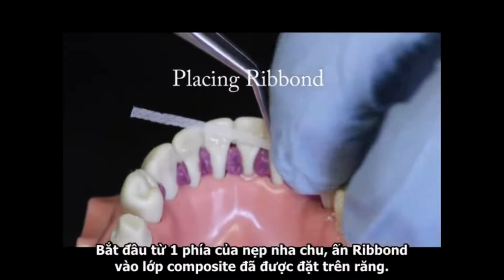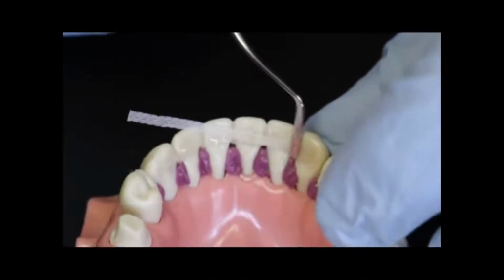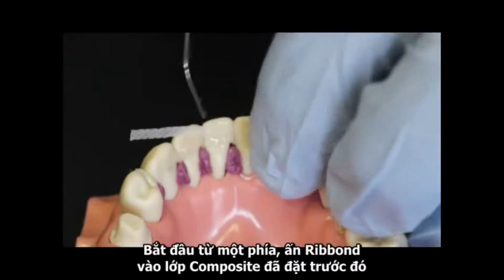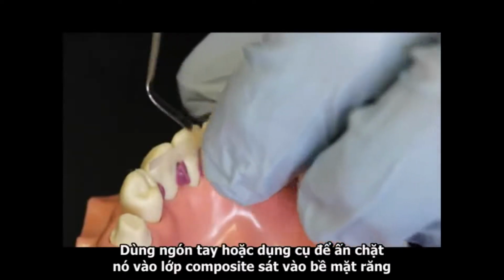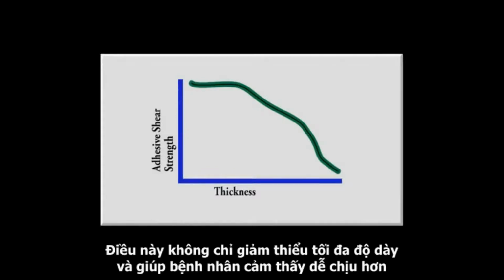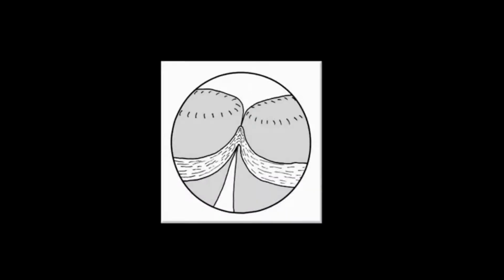Starting at one end of the periodontal splint, press the ribbon into the composite resin that was previously applied to the teeth. You can use your fingers or an instrument to press it through the composite closely against the tooth surface. Remember, the thinner the bond line is, the better the results, so try to displace as much composite as possible. This will not only minimize bulk and aid in patient comfort, but it will also maximize the laminate effect.